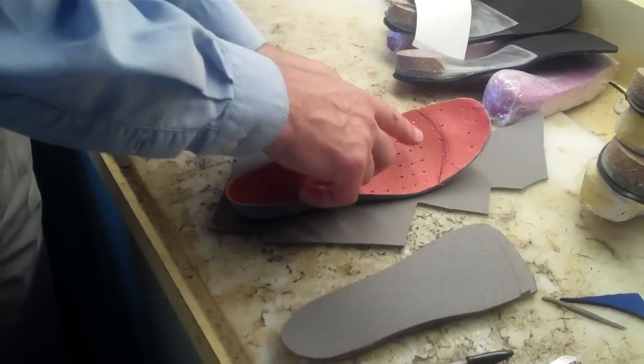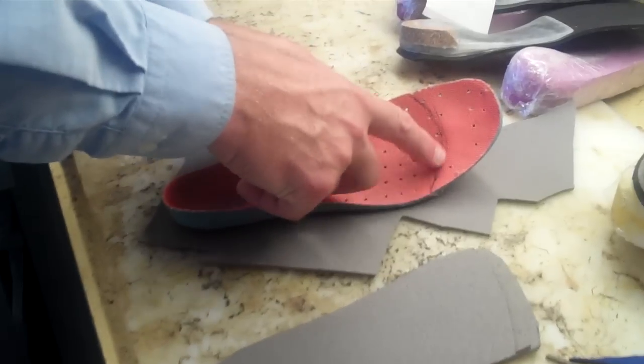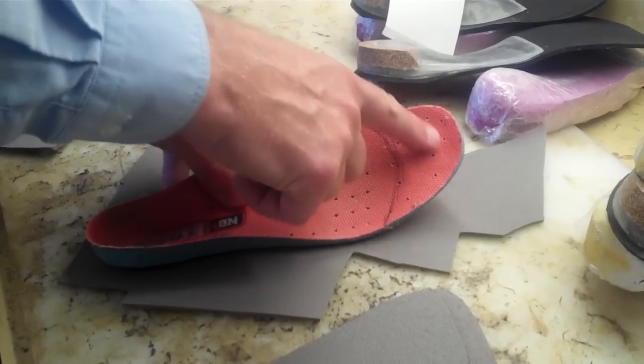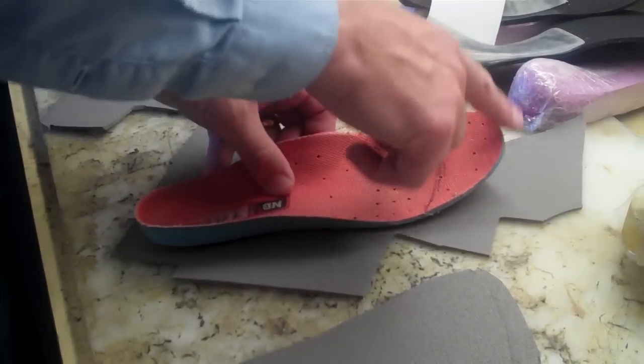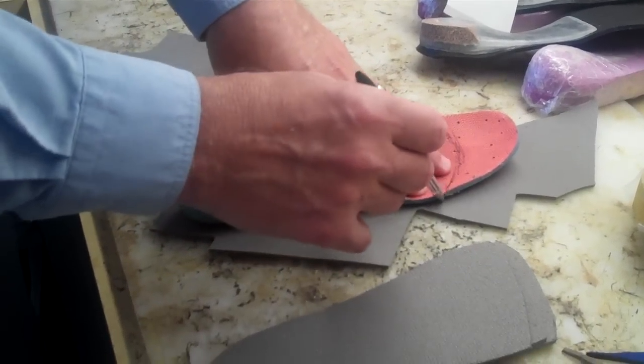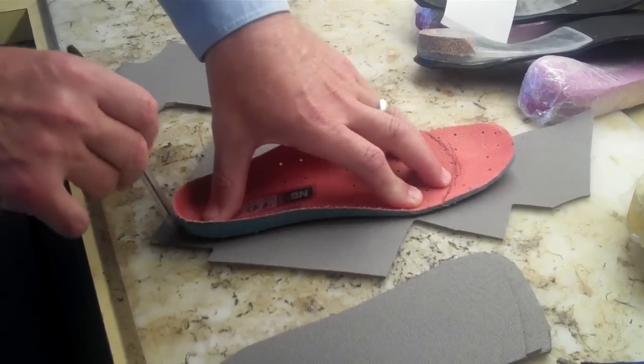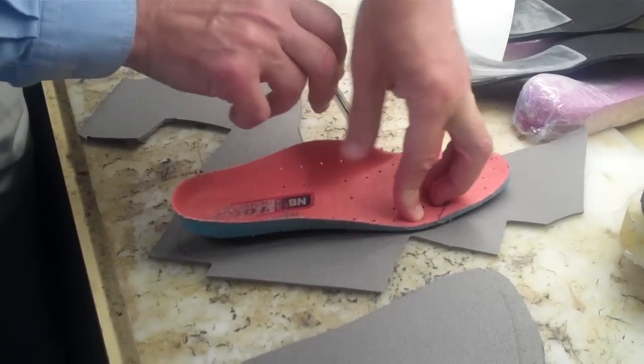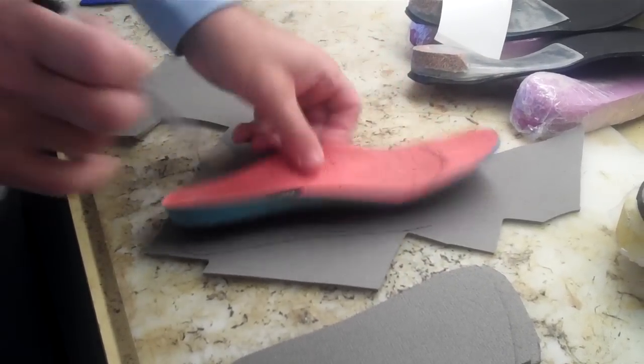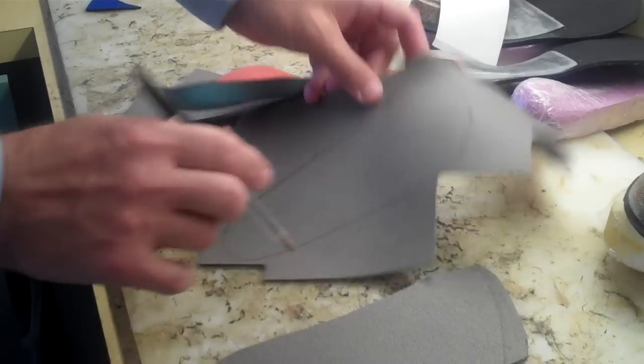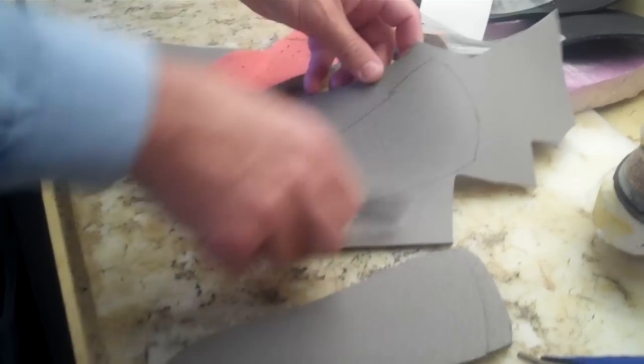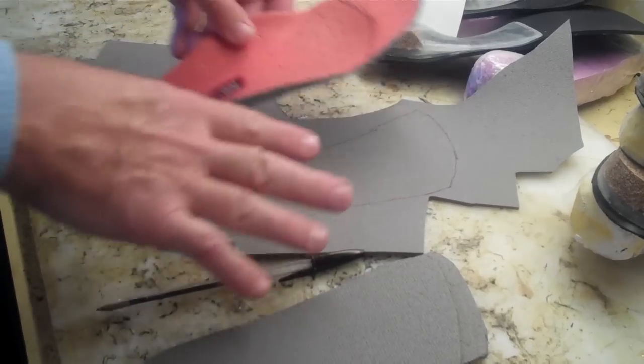So you first mark where the sulcus is so that the toes are going to be free with the lifts and not crowded at the end of the shoe. Then you mark when you make the lifts around the shoe insert, sort of connecting the dots up in the front, and then you cut these out to make your lifts.